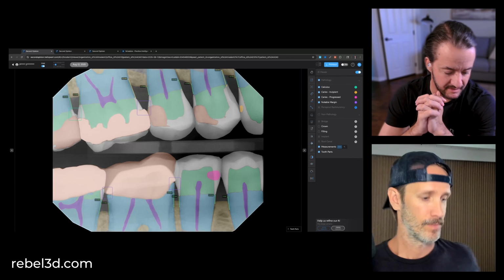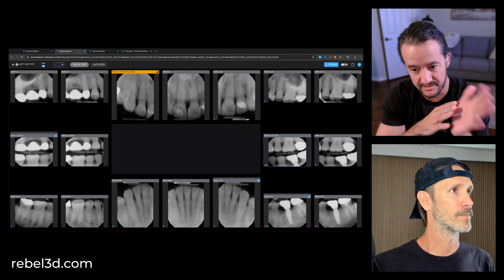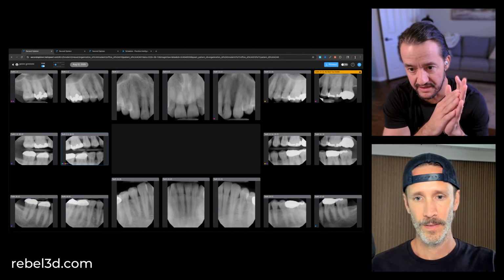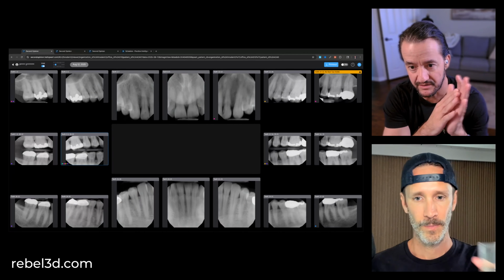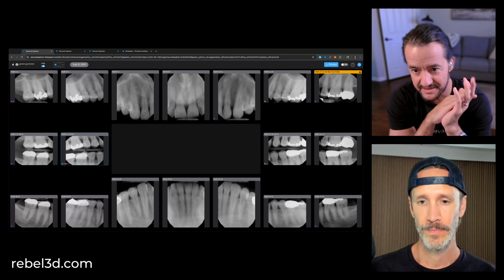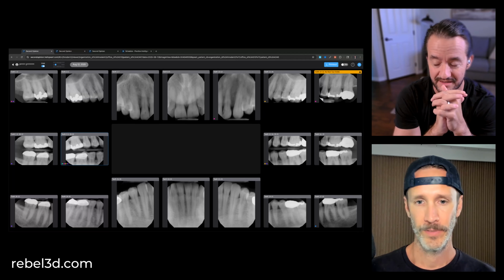100%. Like, if you're advising a patient, hey, there's this small yellow lesion, let's take care of that so you don't need a filling or you don't need a crown. I have a plan to take care of this before it becomes bigger. And my guess is the cost and the treatment for that is significantly less than the cost of a crown, right? So there is a cost to it, but let's be proactive and take care of that now before it becomes something bigger. And yes, that's preventative medicine, and it's lower cost, and it's going to save my natural tooth for longer.